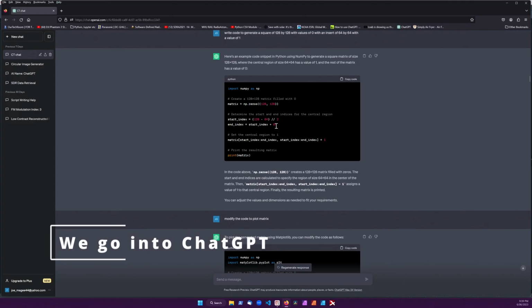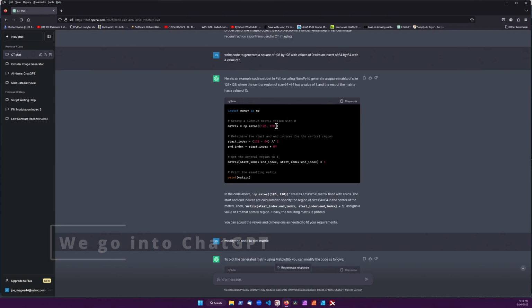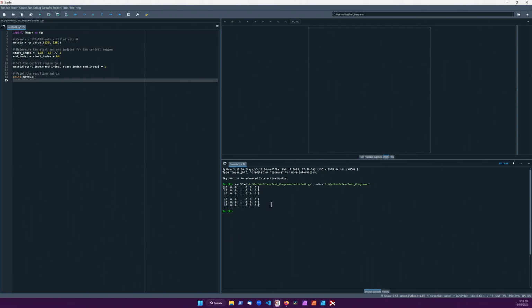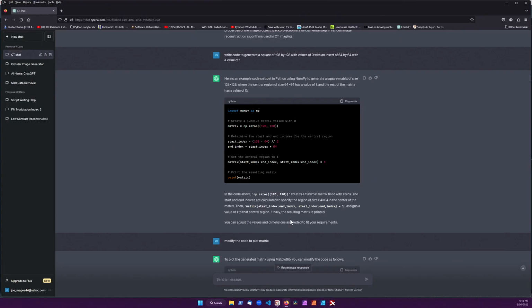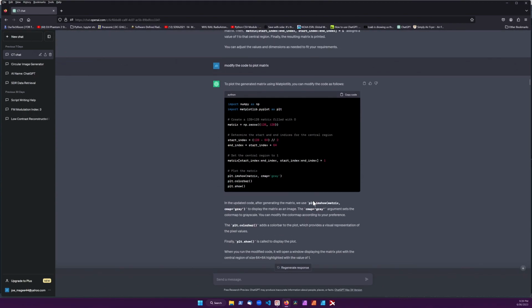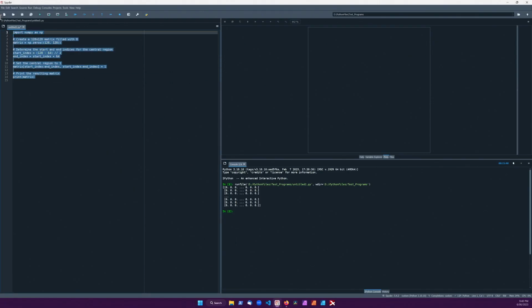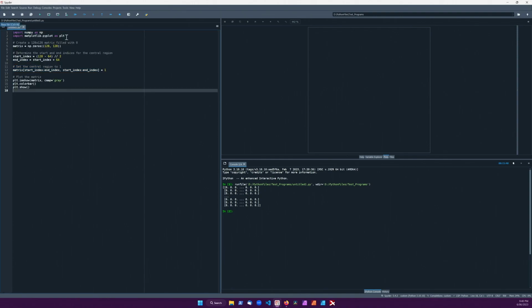I thought I'll get it to write code to generate a square image of 128 by 128 and see what that did, and it came up with this little bit here. So I'll copy the code from there, go into Python, run the code, and up she comes with a whole lot of data. That's not what I wanted, so I'm back to GPT, and I said modify the code to plot the matrix. So it generated this code, so I'll copy that, go back into Python and put that code back in.